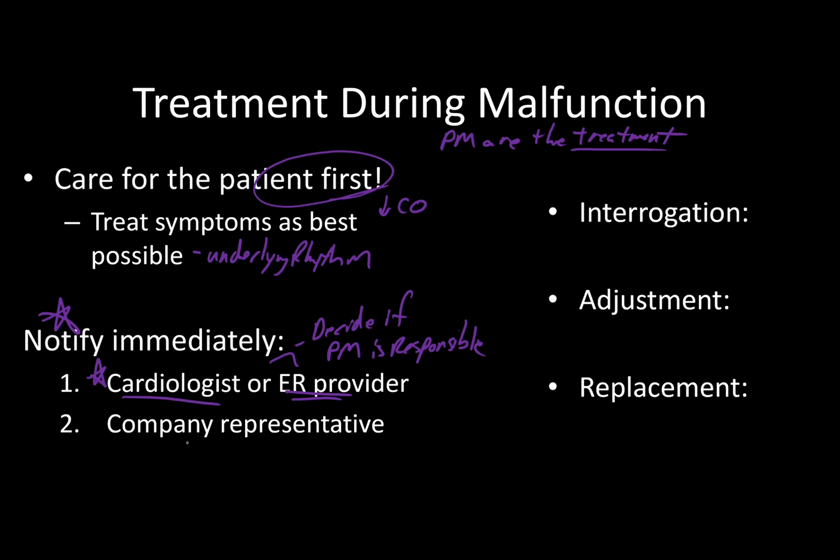Another great source of information, and someone you may want to contact at the same time or at the behest of whoever the physician is caring for the patient, is the pacemaker reps. They are a great source of information. Even if you just have questions, I've always had great experiences contacting them about patients and their pacemaker function. The patient should have a card on them.